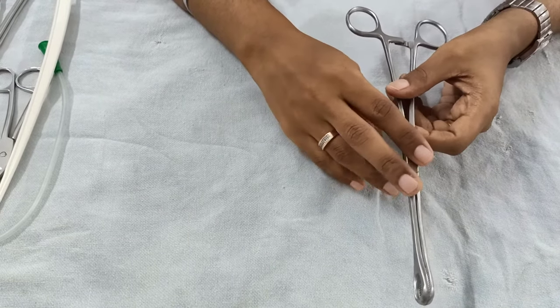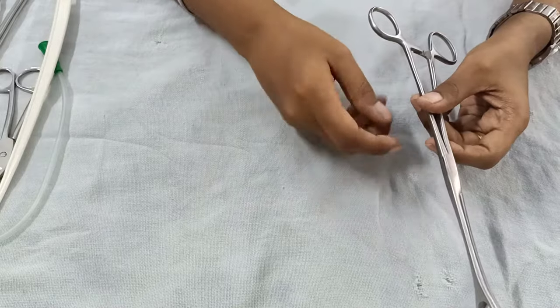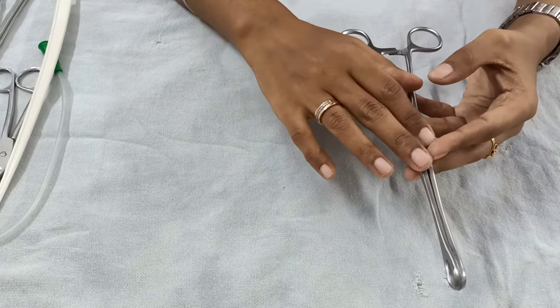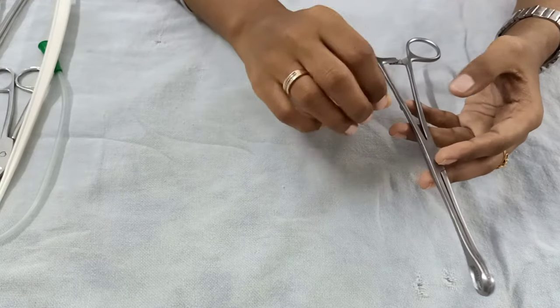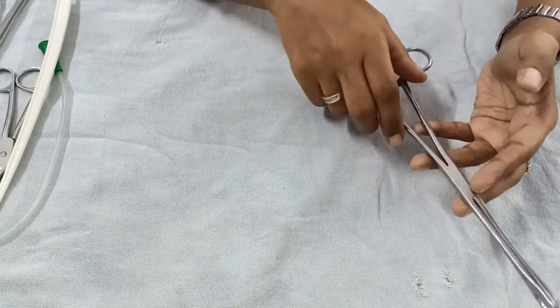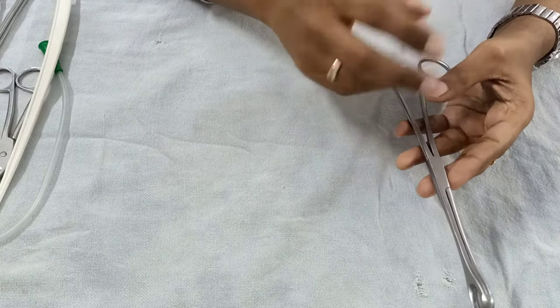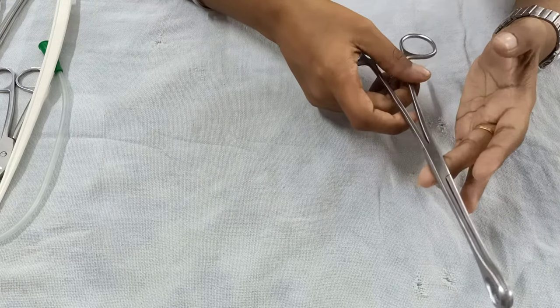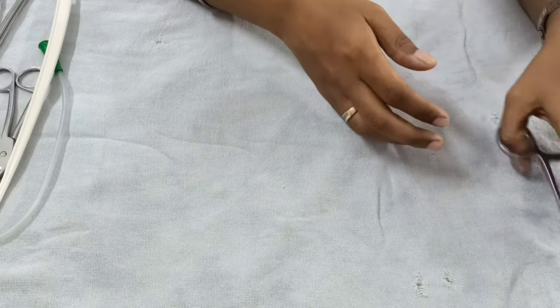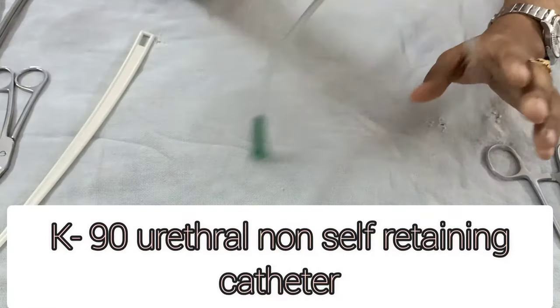This instrument in vaginal delivery can also be used after delivery of the baby for cervical tear exploration. At that time you will require four of them. We use the sponge holding forceps for the pregnant cervix lips because those are very edematous, and using a valsellum instead would be very traumatic for the cervix.